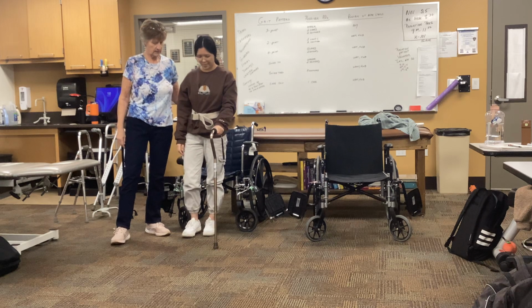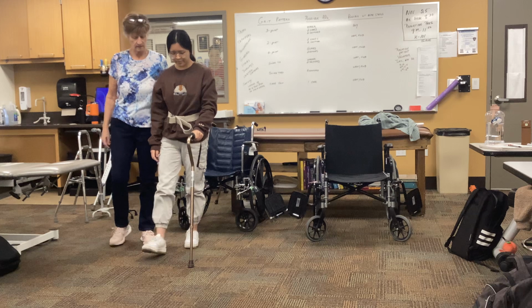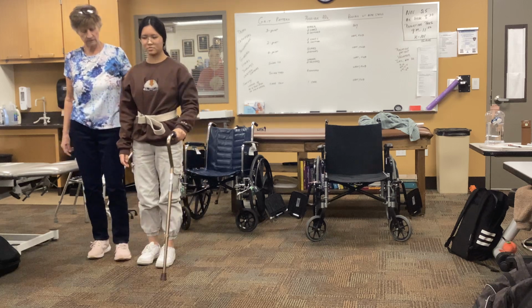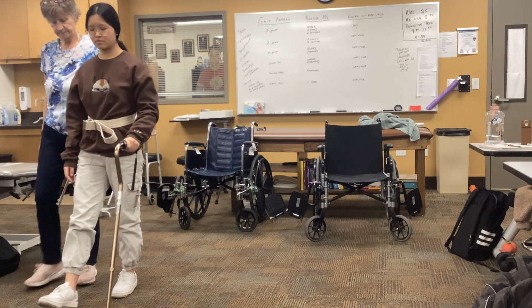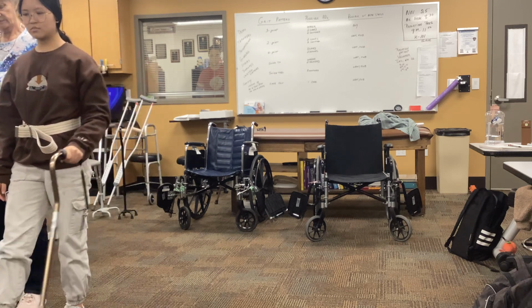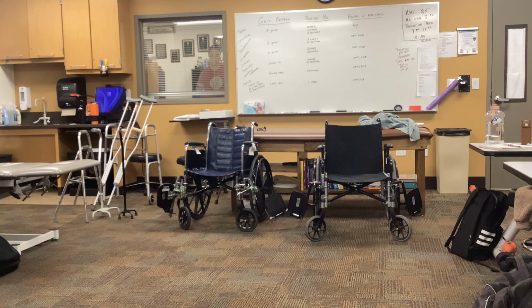Okay, so cane, right, left, cane, right, left. Okay, and then go ahead with a progression. And then stepping all the way through. All right, so let's just go to the stairs.